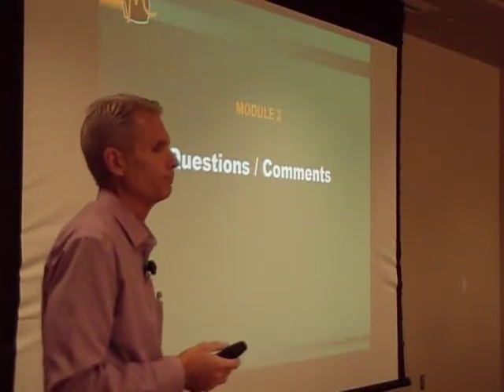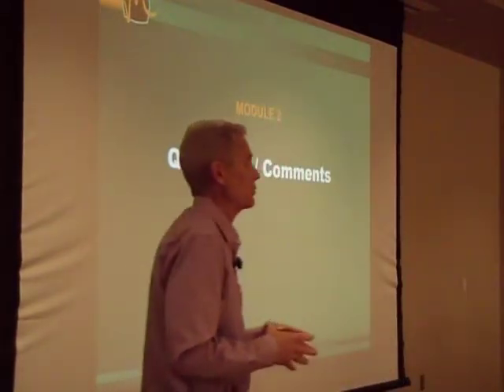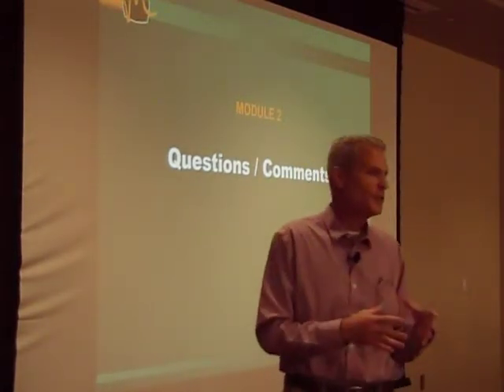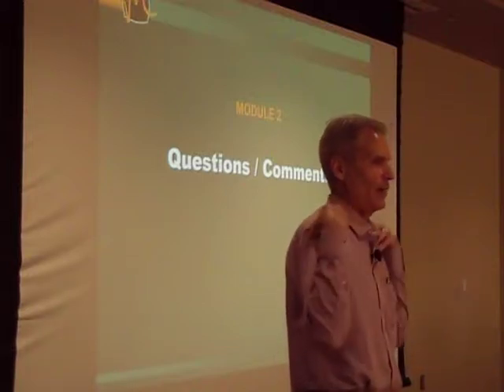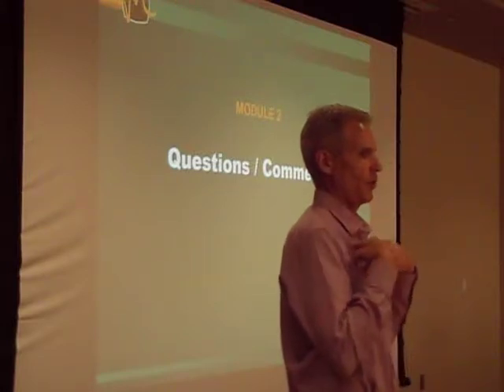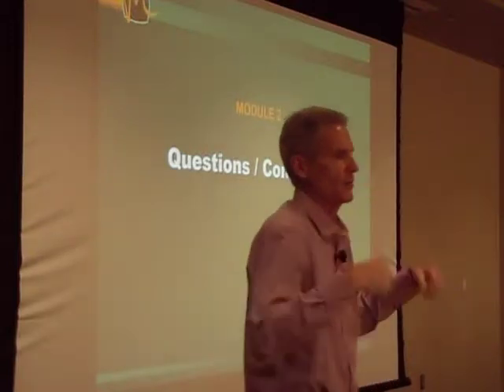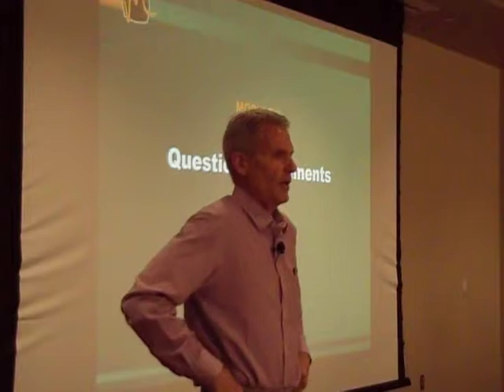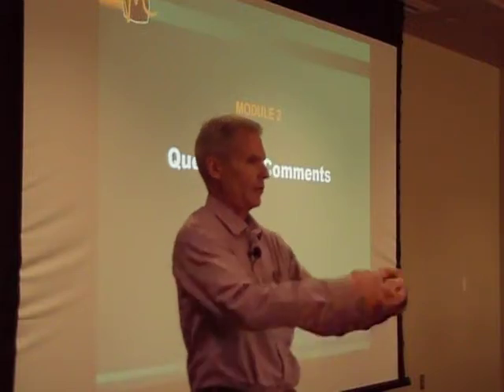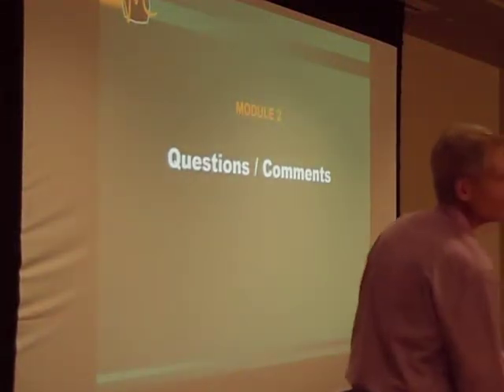Yes? On the primary four leads, what's the best placement when you're putting them on the body? So her question was about the primary four leads as far as the body. We always taught in Lucas County creases and crests. On the arms where they attach to the chest, here's my crease. So we want them just above that and in. We want it on the median area of the chest, not on the bone. And then crests, find the iliac crests, we come up and then slightly in. So we want it here. We don't want them on the belly because if you have a belly breather, their belly's going to float in and out. So we try to keep it lateral. If you take that approach, it makes it a bit easier.